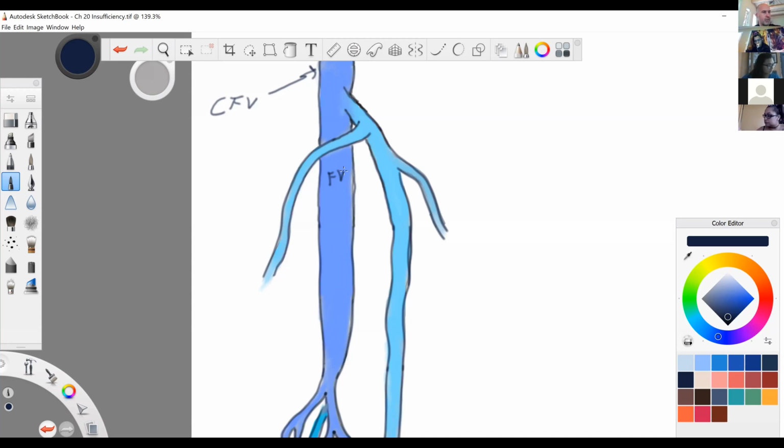In fact, your book has a section where it talks about old terminology and new terminology. And of course, here is the saphenofemoral junction. Really important spot to look at when we're scanning. And soon thereafter, often right away, you'll see another vein going off more laterally, and that is the anterior accessory great saphenous vein. It goes down to the knee. Maybe it branches off down here. Maybe it even has a decent sized branch that reconnects to the great saphenous vein. Who knows? But generally you don't really follow it past the knee very often.